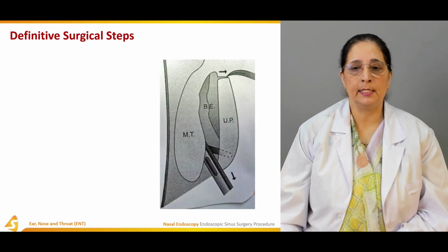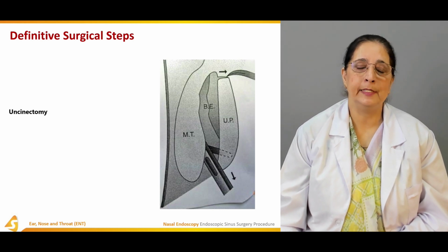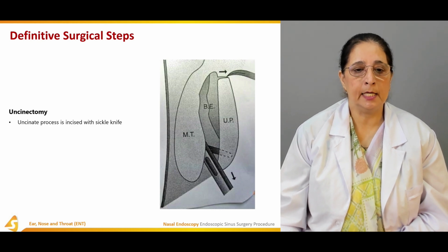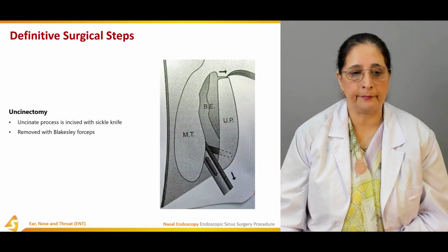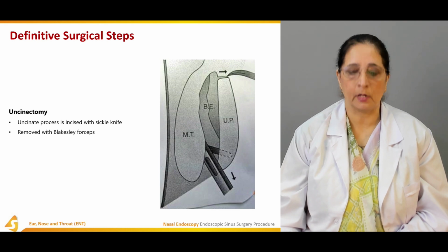Definitive surgical steps. Uncinectomy, removal of the uncinate process. Uncinate process is incised with sickle knife, removed with Blakesley forceps.